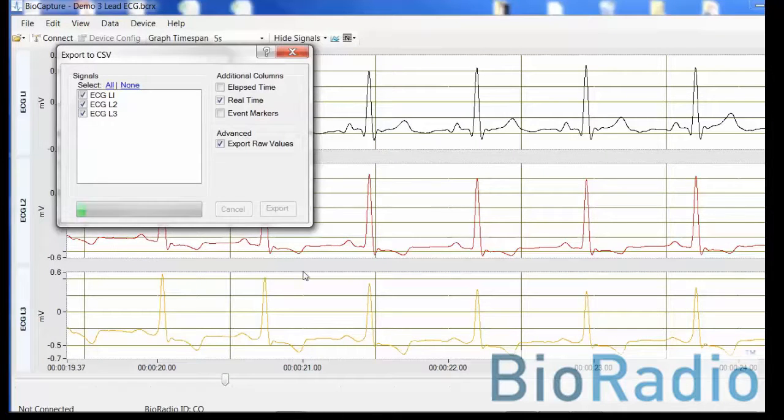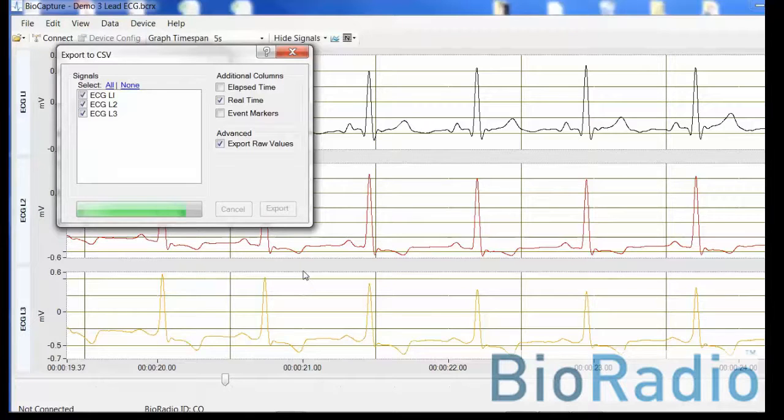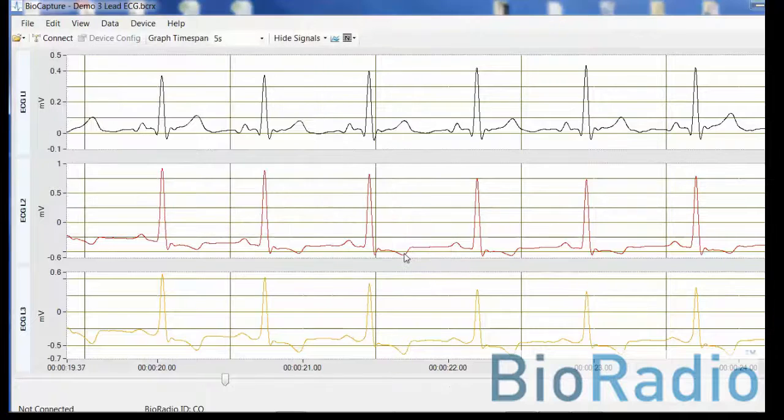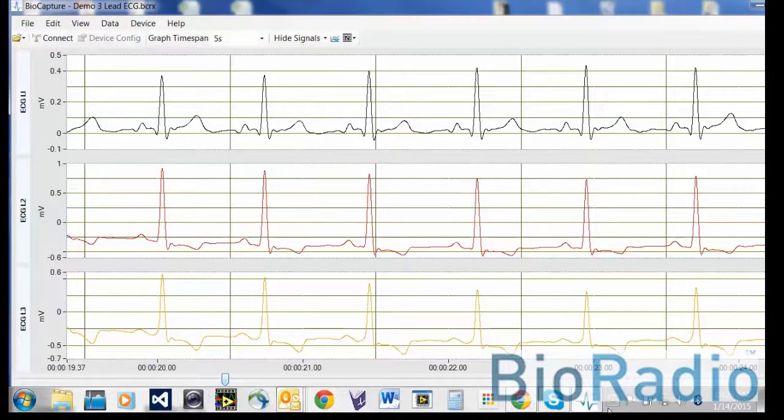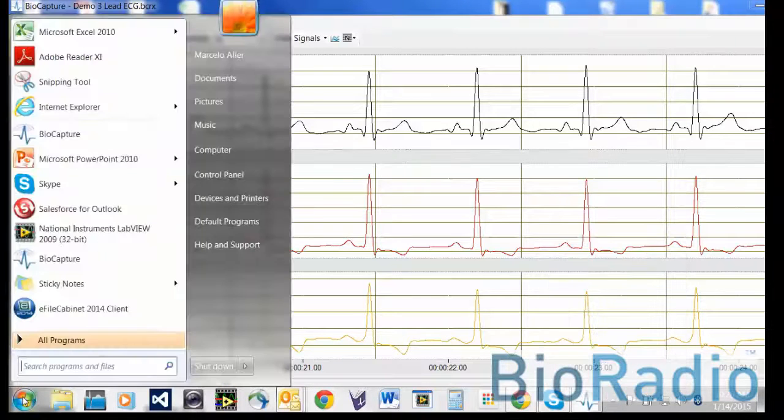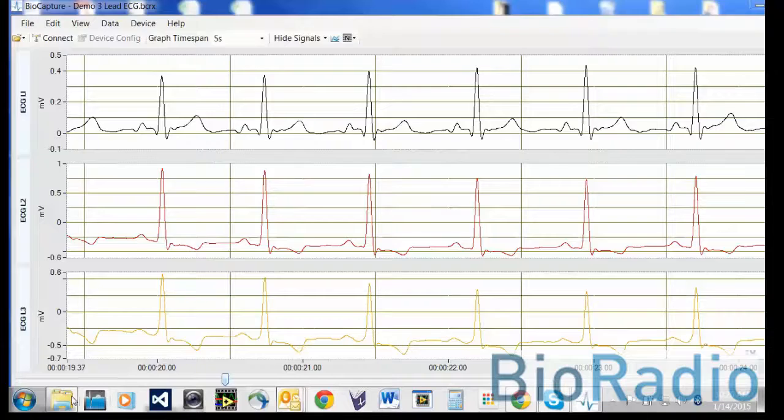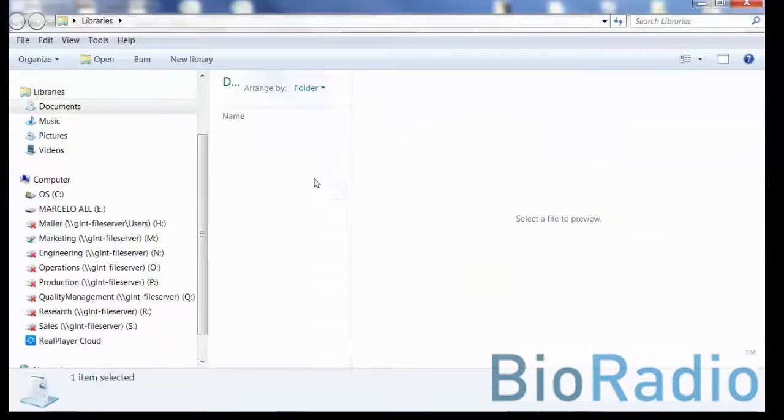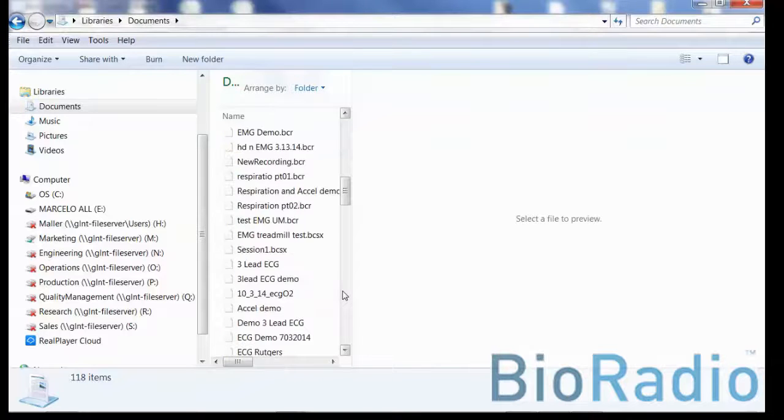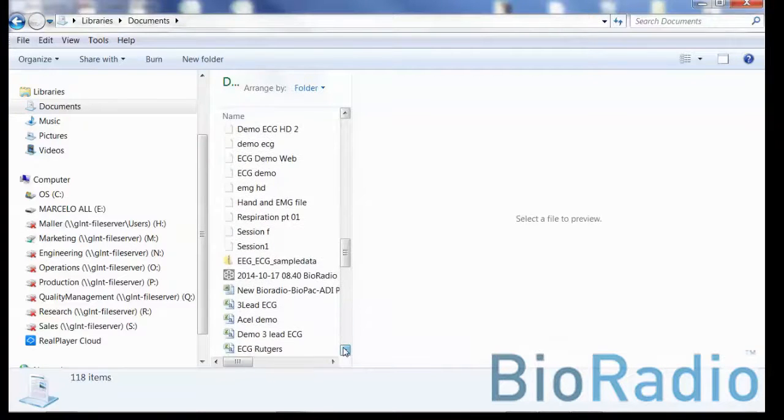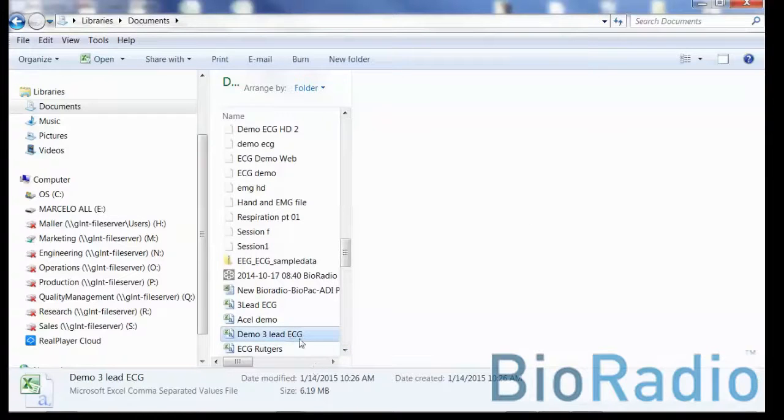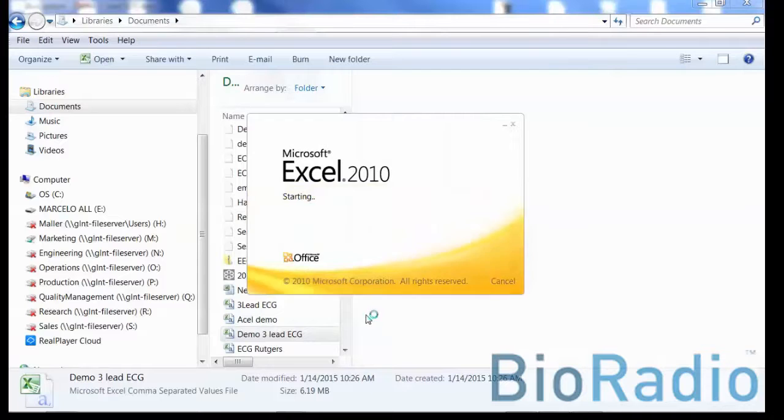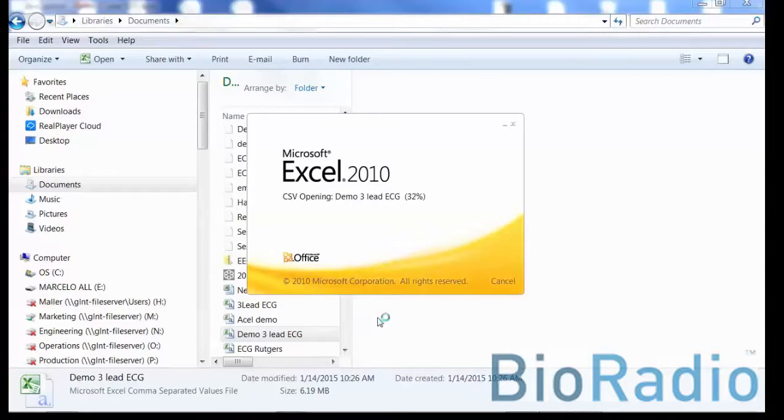And for this video, we will show you what the CSV file will look like. Your export was successful. Click OK. Locate the area where you have stored your file. Here I've located it in the Documents folder. Select the file. As you see, when I open it, you'll have one column that's timestamped and three columns of ECG data.